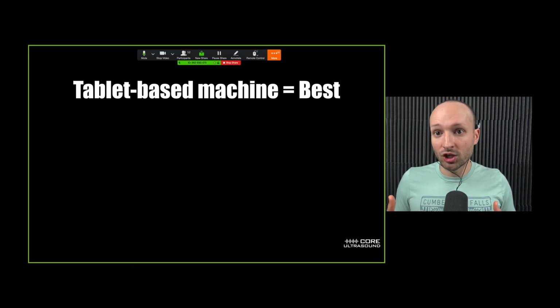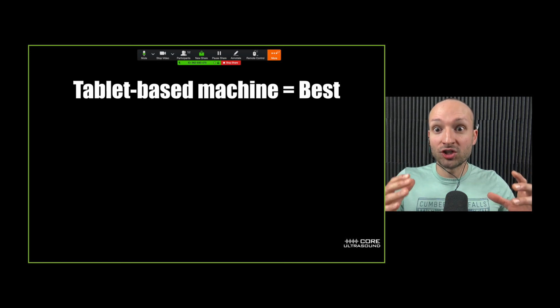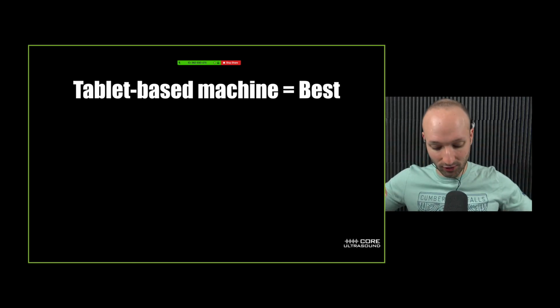What we have at our shop is a Mindray TE7, which is basically a tablet-based machine. The reason I say tablet-based machine is because they're much easier to clean. So it's probably not a good idea to take your machine in there that has a physical keyboard, because it's very hard to clean that physical keyboard adequately because you get little things inside the keyboards or whatever.